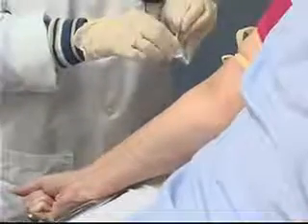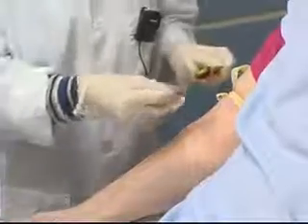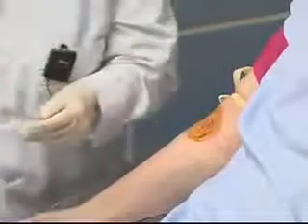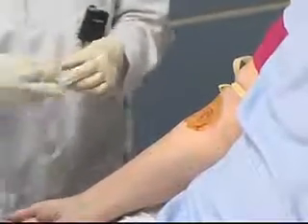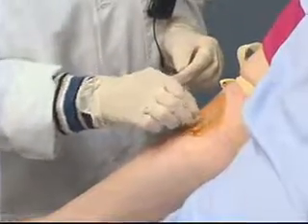I'm going to clean the area first with some povidone iodine solution, starting in the center and cleaning outwards in a circular motion. Allowing that to dry, I can then clean the area again from the center and working outward in a circular motion with an alcohol swab.